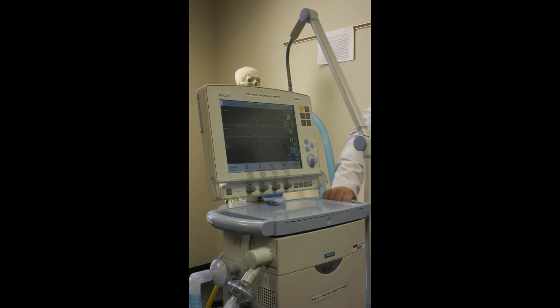So you just put the number. If it's pressure, it'll be minus. If it's flow, it'll be plus. Okay, good so far? Okay, so that's set parameters.